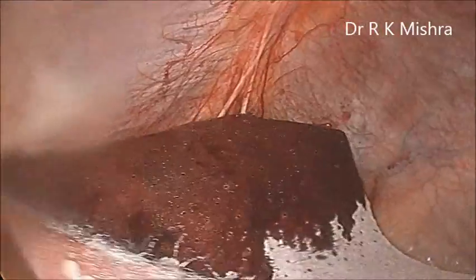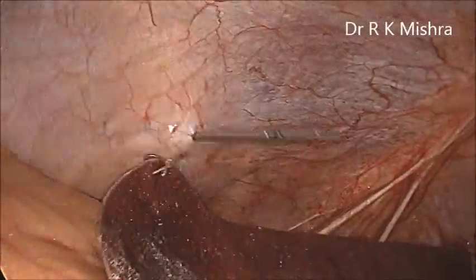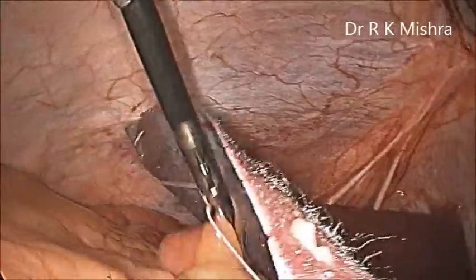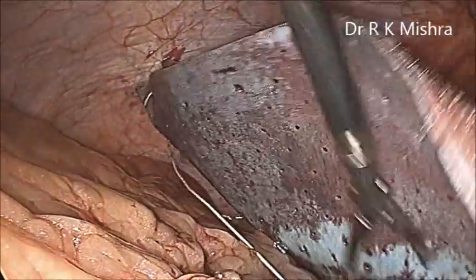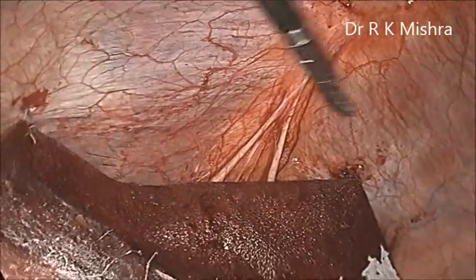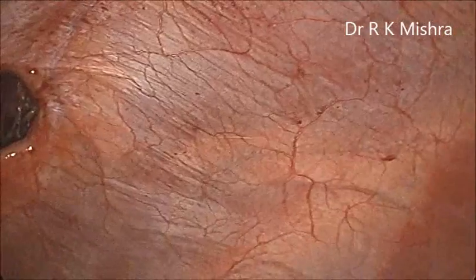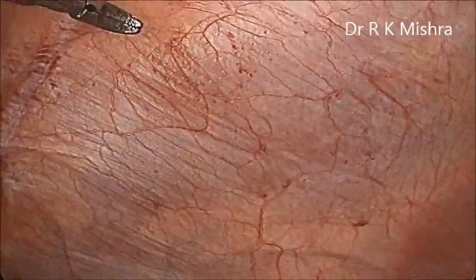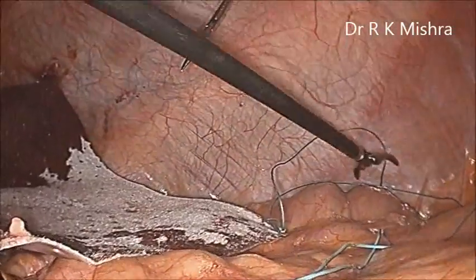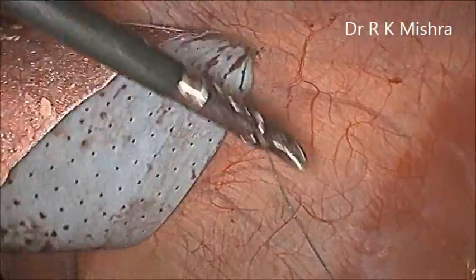You have to keep the white color towards the abdominal wall, and the blue color — which is stained now — should be towards the viscera. That has to be taken care of in dual mesh. In Vipro mesh you can keep it either way, upside down, and there is no problem. But in dual mesh, correct orientation is required. Marking of the mesh has already been done above, and the marking should be done approximately two to three centimeters lateral to the corners of the mesh, so that when you pull it there should be proper stretch.